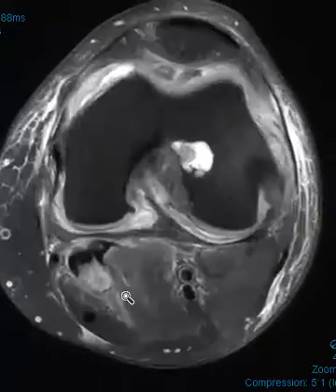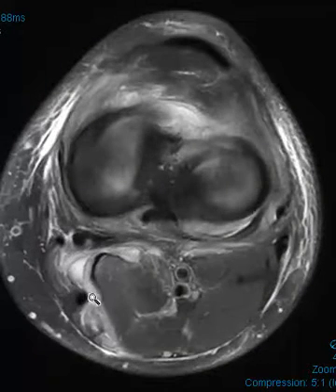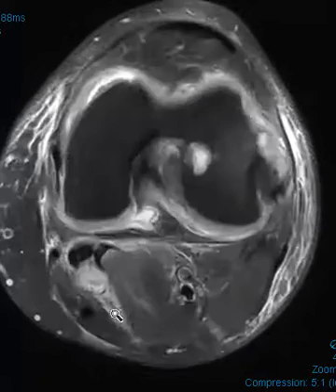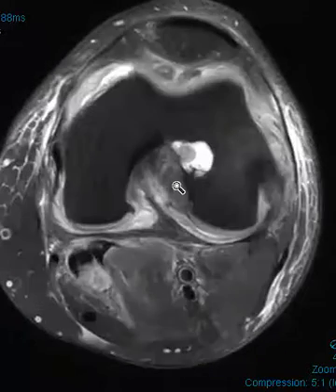If we come back here, we can see that there is some fluid in the gastrocnemius semimembranosus bursa, but it's very complex. It looks like the synovium is thickened. It's really indistinct. It's hard to tell where the fluid is in the thickened synovium and around the periphery. Also maybe some leaking of fluid here back along the medial gastrocnemius muscle. Kind of just a funny look to it.